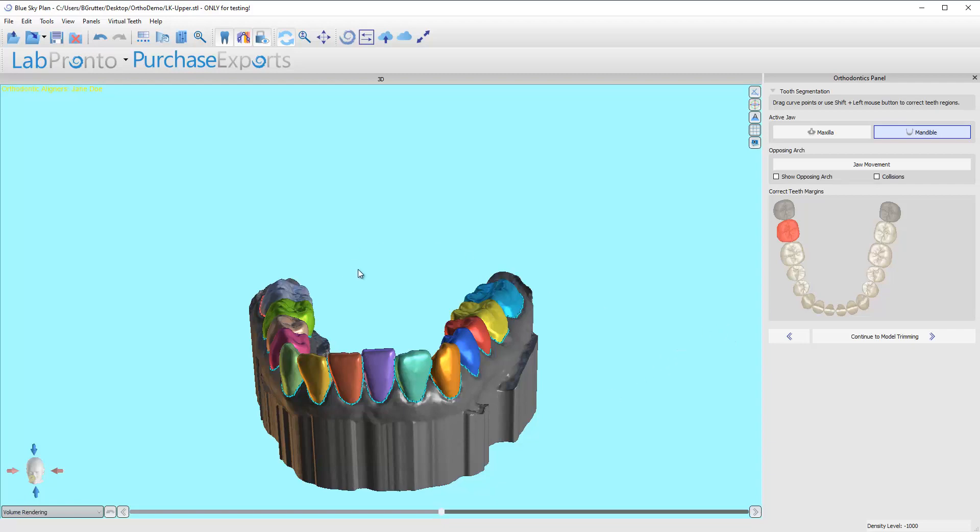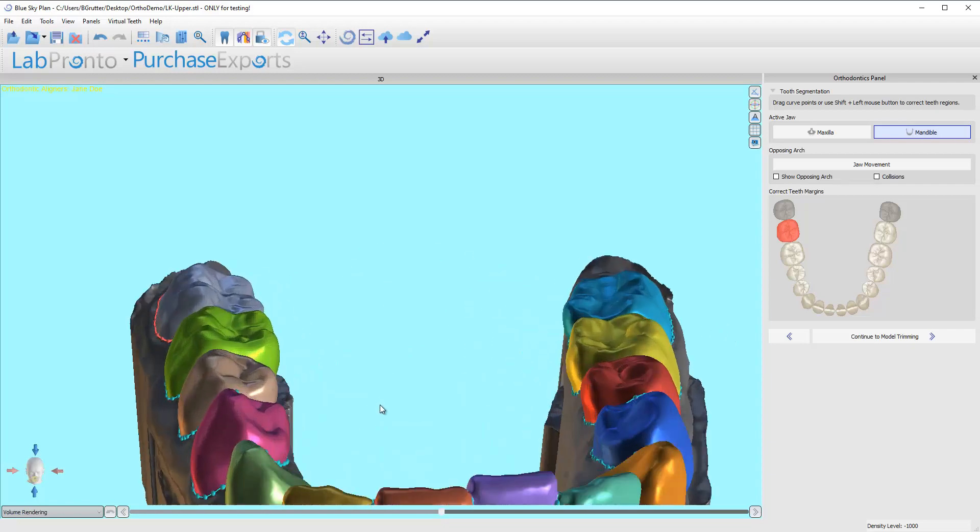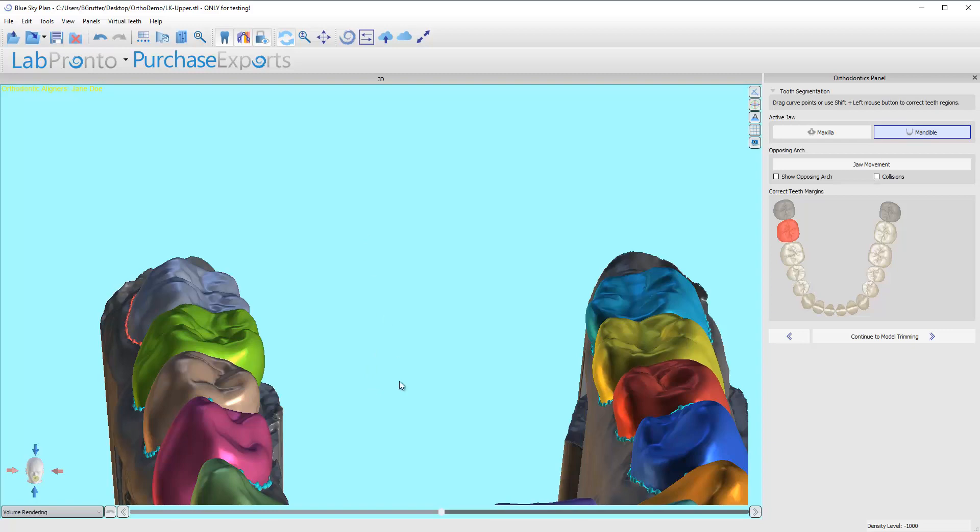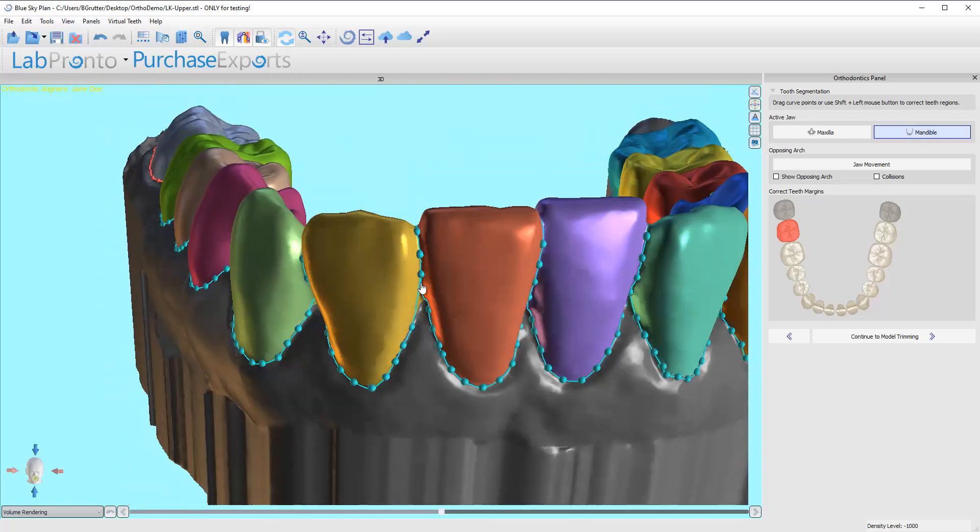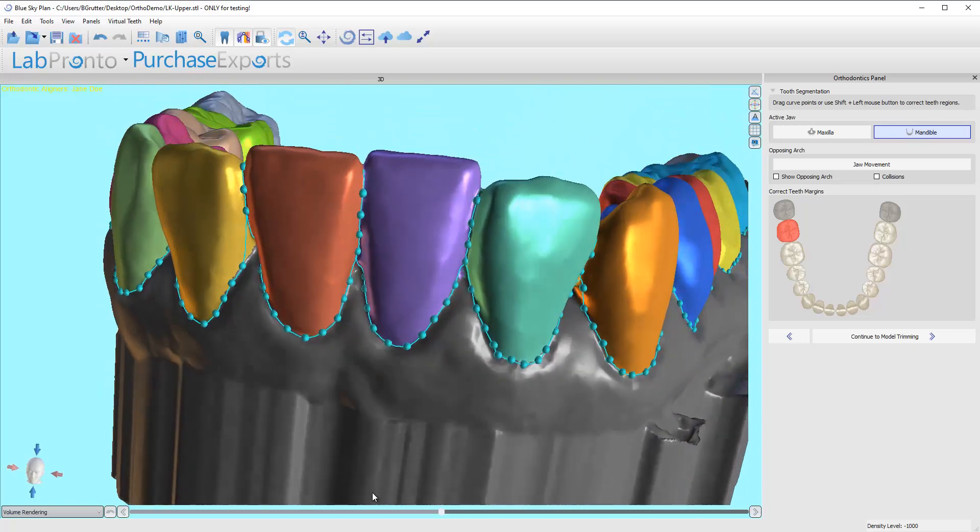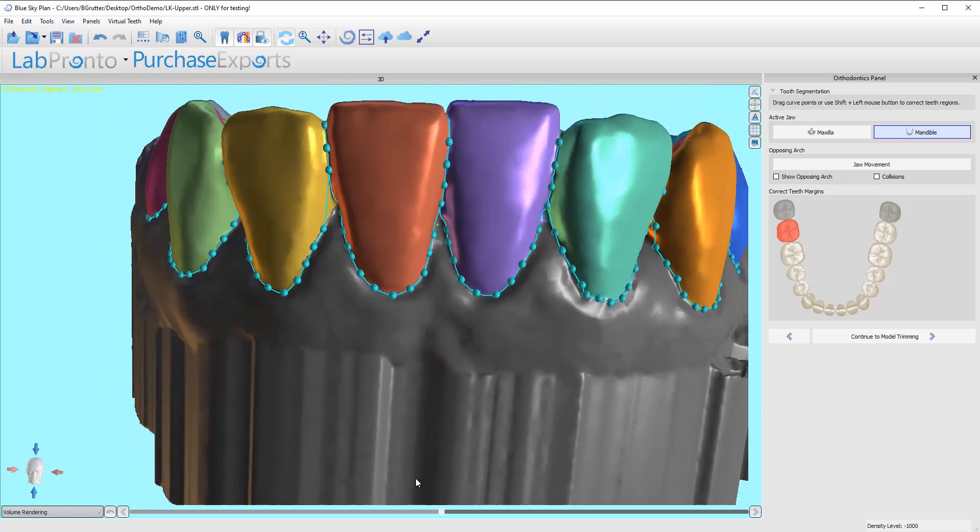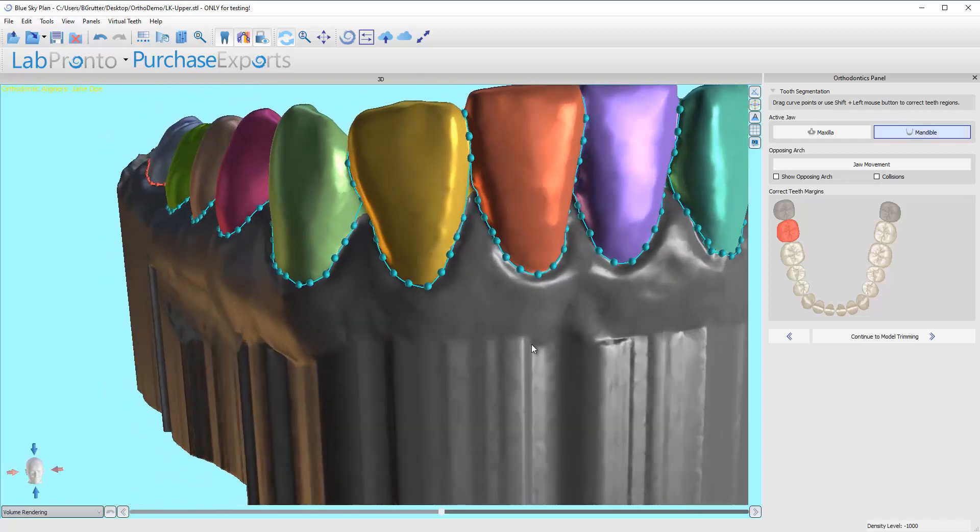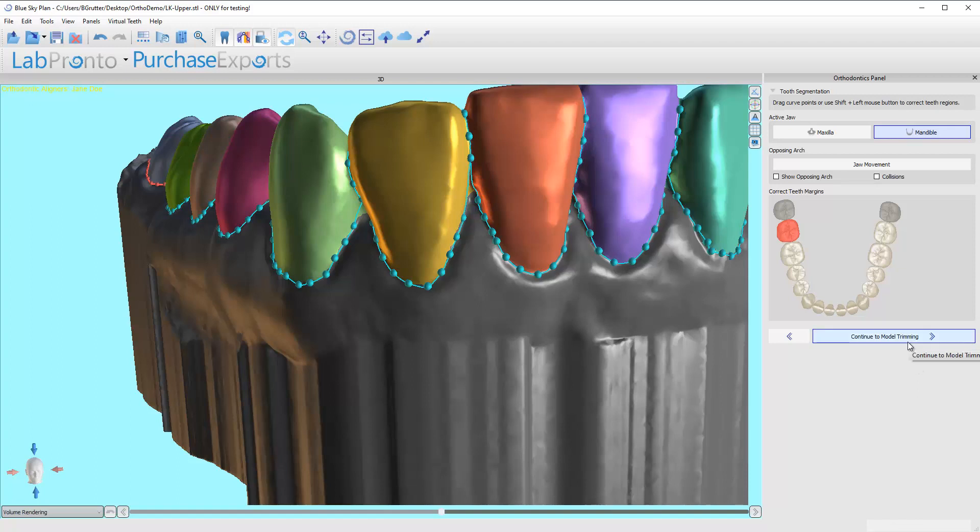So let's go ahead. I just saw something I wanted to take a peek at. No, that looks good. All right, I'm going to click on model trimming. And that will be the next stage.